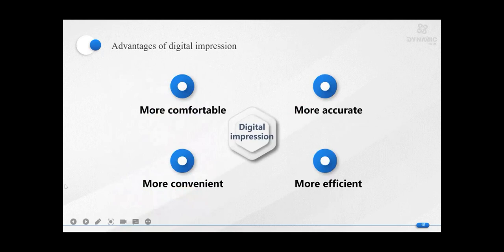So for data sending and transmission to the lab online, it reduces the time and risk of the model carrier, and facilitates the storage of patients' models. The last one is more efficient doctor-to-patient communication, which has changed from traditional language to more efficient visual methods.